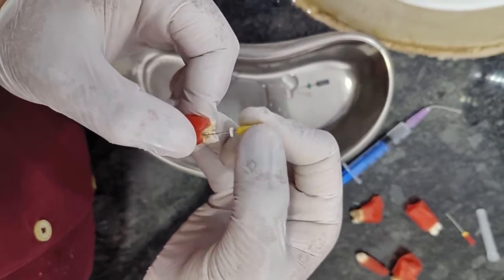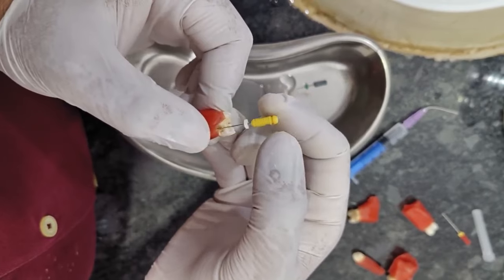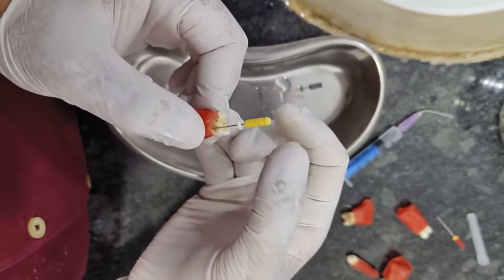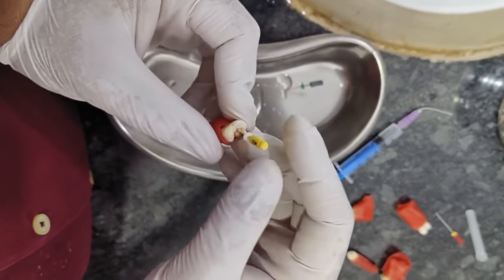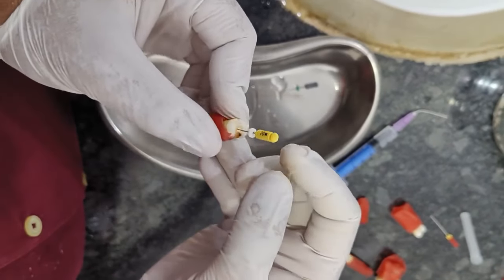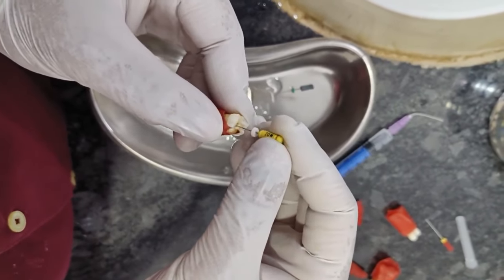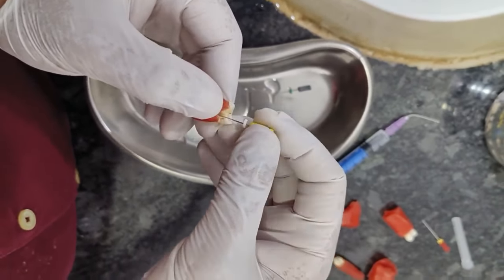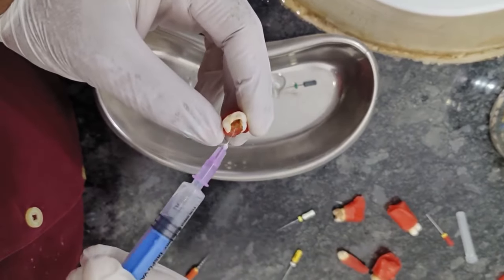give a lot of pressure on the file, thinking that the file will go inside, but it will not happen until and unless you have previously cleared the canal with number 15 or a smaller file. So if you put a lot of pressure on this file, it will cause ledges in the canal, or it will cause file breakage. So remove it, don't push the file, irrigate it once again.